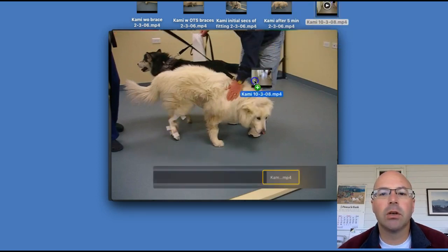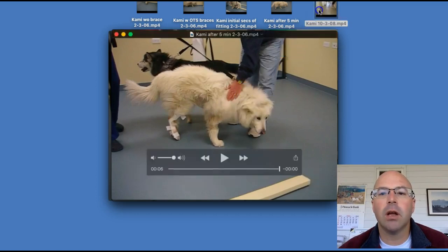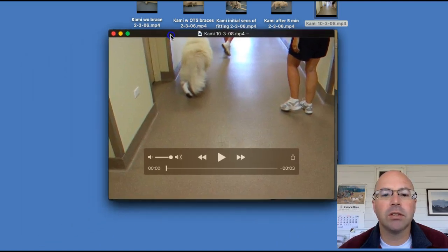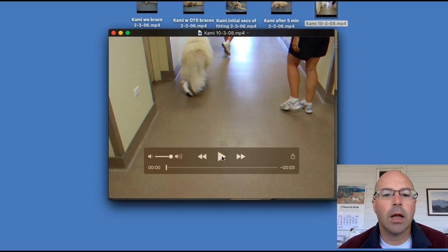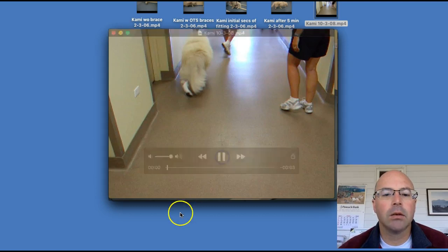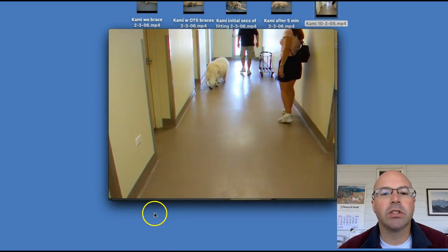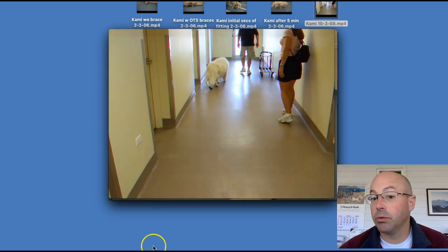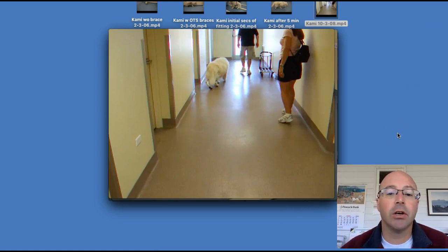Here's the cool part — this is three years later. She came back for another set of braces. She's walking much better. There's still some pivoting, which is from some hip weakness, but she was getting around really well. Her mom and dad had taken her out on the sandy beaches and playing. Their life was back to where it was before.